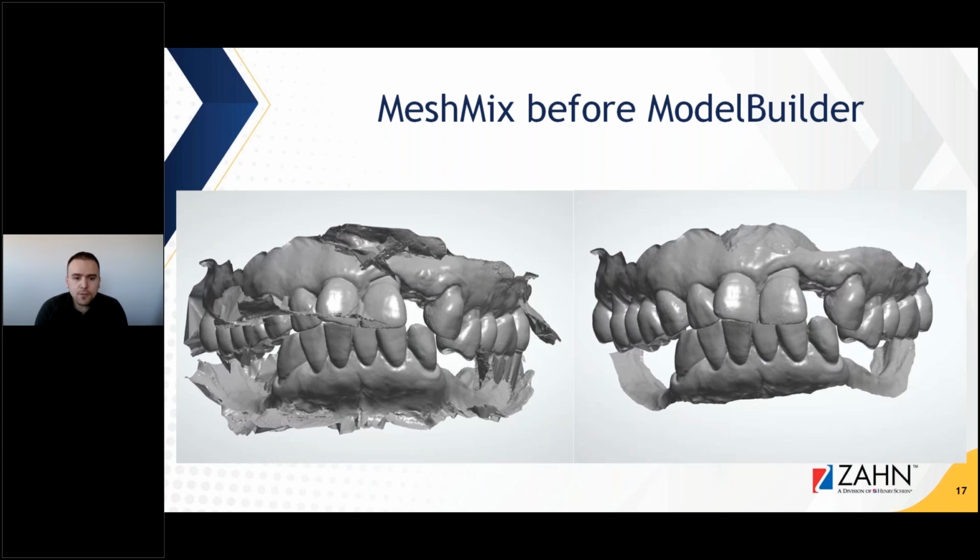It's an original tendency to just take the intraoral scan and throw it in the 3Shape, let's say 3Shape ModelBuilder, and start working on it. And then once you're in there, you get stuck. You get too many errors. You can't trim your model correctly because there's too many things going on. The software doesn't know what to look for, and you end up spending 20 minutes designing one model, which really should be done in under 5 minutes.